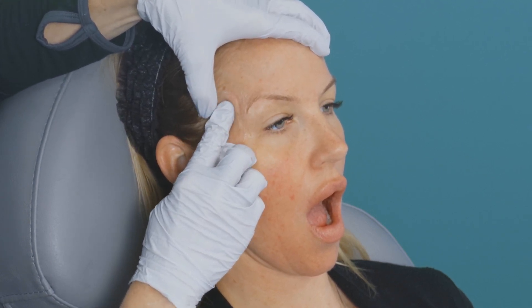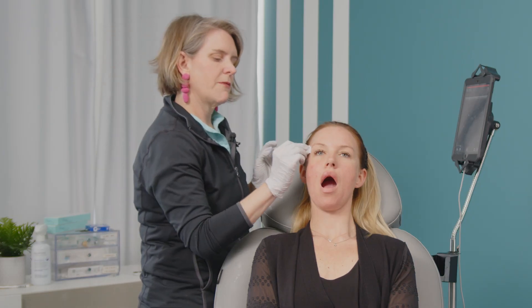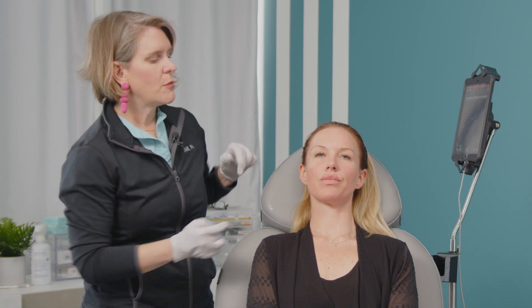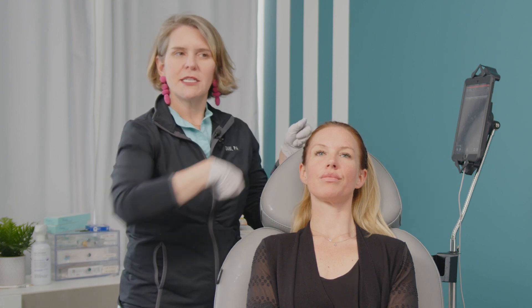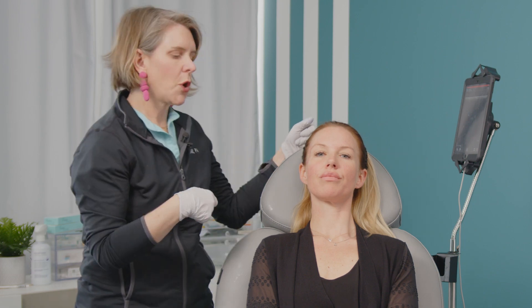She is a little hollow so she could probably use a little bit more. What I do is usually start with one syringe, let it get into the tissue, and take a look before adding more. Close your jaw for me. With a nice low G prime product, just smooshing it down with your thumb a little bit, you're able to have it spread instead of using the cannula up and back. So that is ultrasound guided with a cannula.